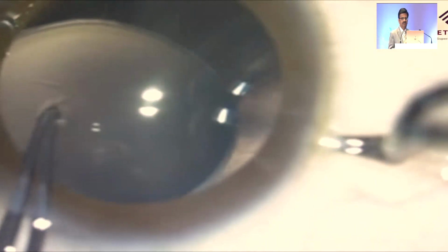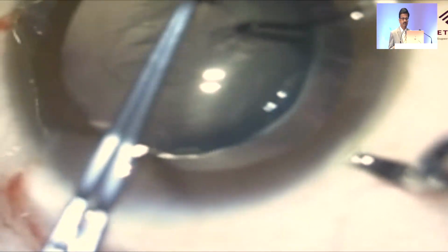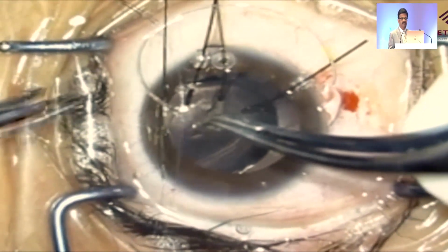In this case, you can see this is almost more than 180-degree subluxation, in which again the capsular hooks are used to complete the capsulorhexis. And then, towards the subluxated side of the lens, we make a scleral pocket and scleral flap.